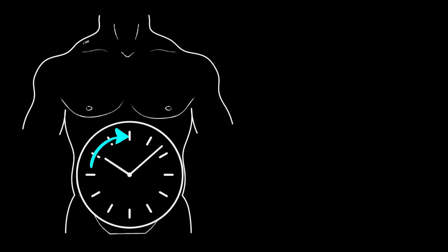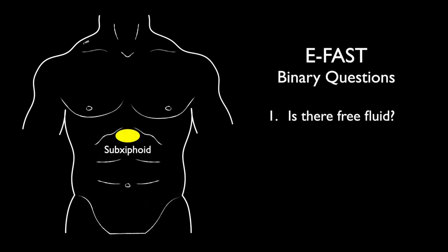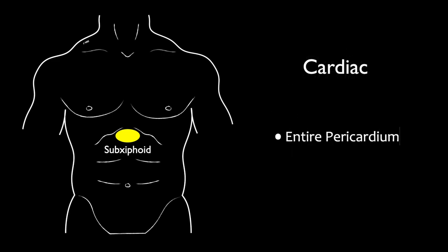After finishing the right upper quadrant, we go to the sub-xiphoid area. I would suggest making the right upper quadrant and sub-xiphoid your first views, as these will most often explain why a patient is hypotensive. In addition to evaluating the pericardial sac for free fluid, we may be able to evaluate heart function. When looking at the cardiac evaluation, we want to see the entire pericardium to evaluate for free fluid, and then we need to see the interior myocardial walls to assess for function.